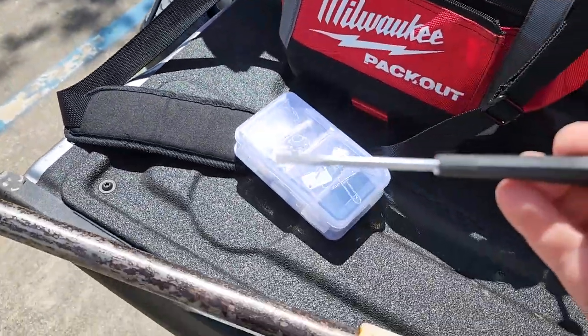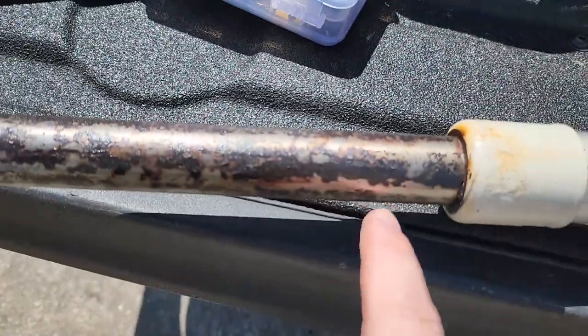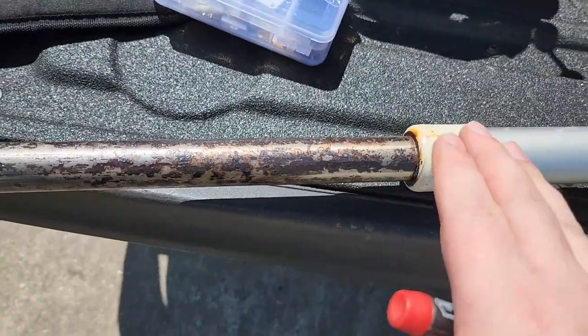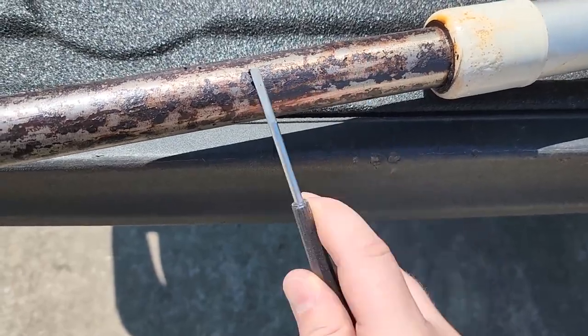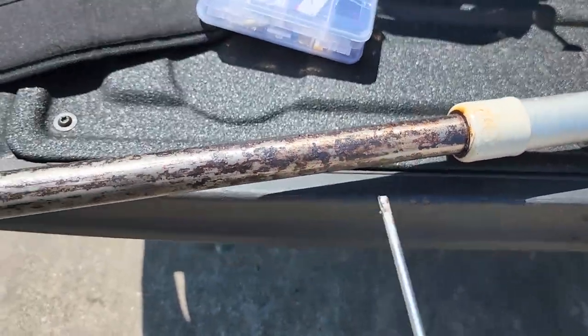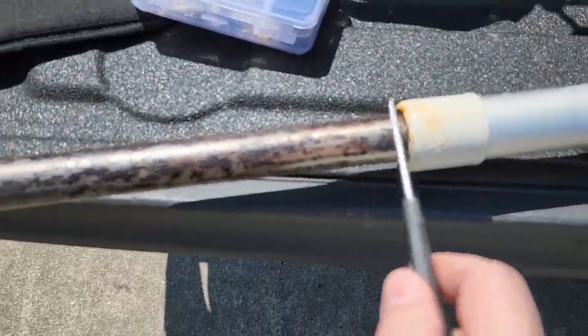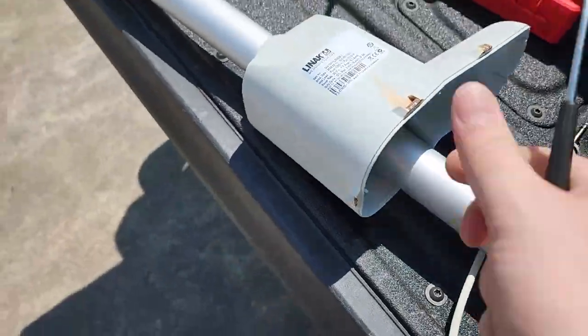All right, I'm going to get my handy dandy little screwdriver here. One of the things I want you guys to realize is this linear actuator does have some pitting. Now it's nice and shiny because I cleaned off a lot of the pitting that was on there. You can see that. I cleaned it off and I put a layer of grease on there. The grease also helps loosen up the rust, so I'm gonna let that sit on there for a minute.